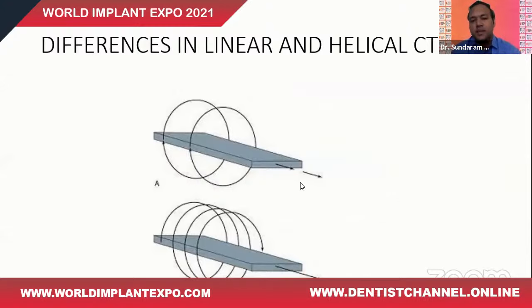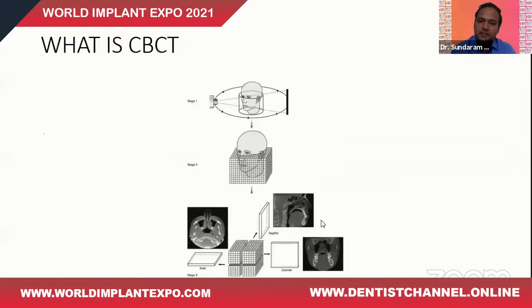This picture demonstrates the main difference between a linear and a helical CT. So in this first picture, there is a single rotation of the X-ray source, and then the patient on the structure will be moved a little, and then comes the next round. This is what the linear CT is all about. The helical CT does a continuous spiral of motion around the patient, making possible all the 360-degree slices that are needed. So this would be the principle of a hospital-based CT.